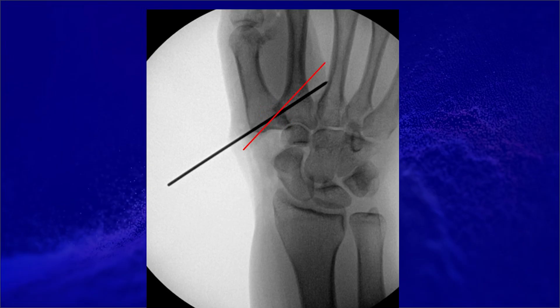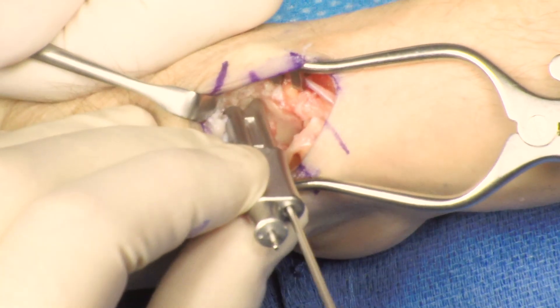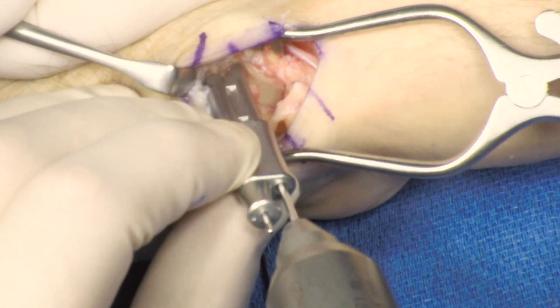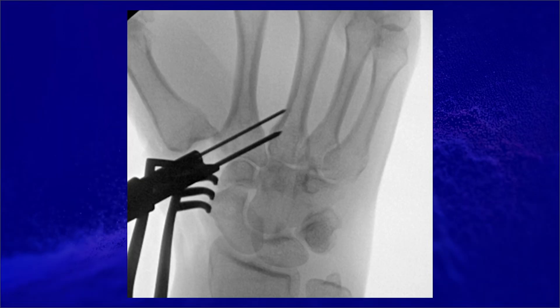You don't want to aim too distal because that will make it harder to pass the anchor through the second cortex. If the angle is too low you will not be able to point the inserter to deploy the anchor. The inserter needs to go 7 millimeters past the second cortex. You also want to raise your hand so the wire does not end up dorsal — you want the anchor between the metacarpals, not on the dorsal aspect of the second metacarpal. The parallel guide is then inserted and a second K wire is inserted bicortically through both the proximal and distal cortex. A fluoroscopy shot can confirm that your K wires are parallel, though it's not necessary.